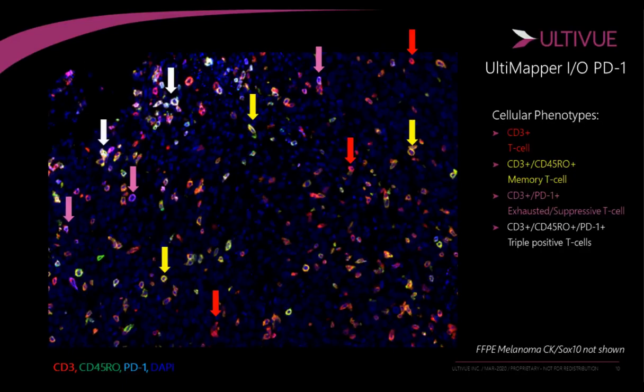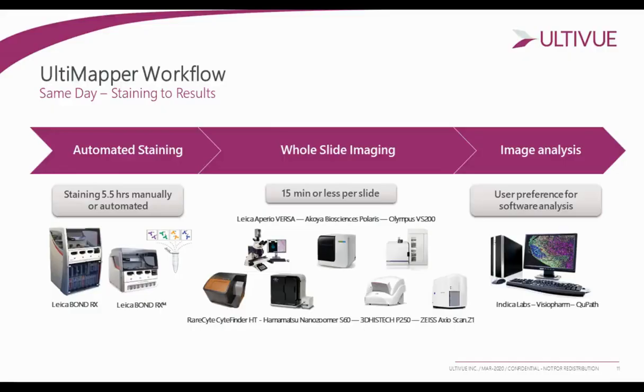One of the other things I'd also like to highlight as you're walking yourself through this image, you'll see cells of different colors and different color variations. You'll see some that are more orange, some that are more pink, some that are more purple. That is very qualitative, just your eye test, showing that there is a significant dynamic range within the staining of our assay here, that you can see low expressors to medium expressors and high expressors. And now if you were to plug this into any sort of standard analysis tool, you'd really be able to further dive into that and start to threshold and categorize these different ranges of expression into new unique cell populations.